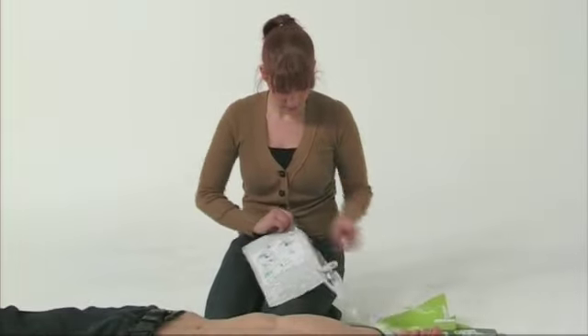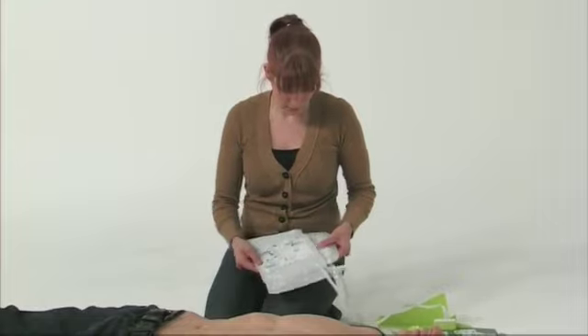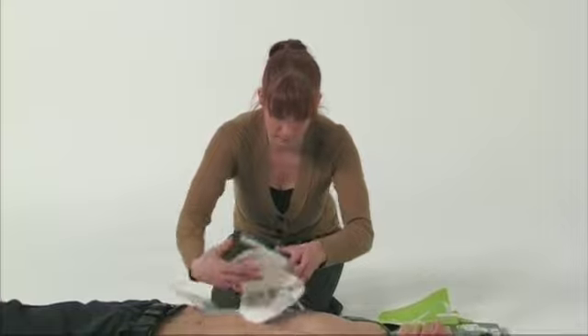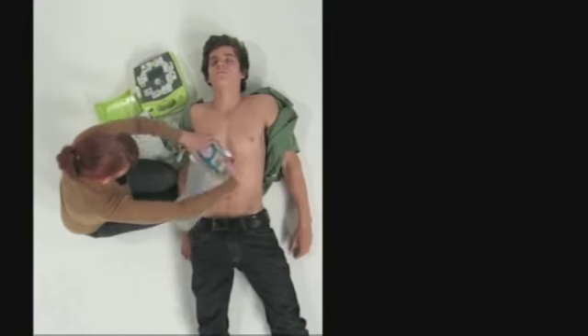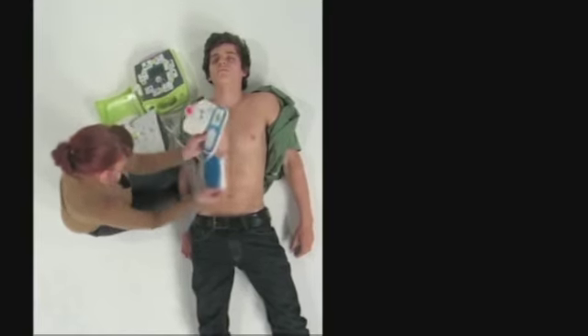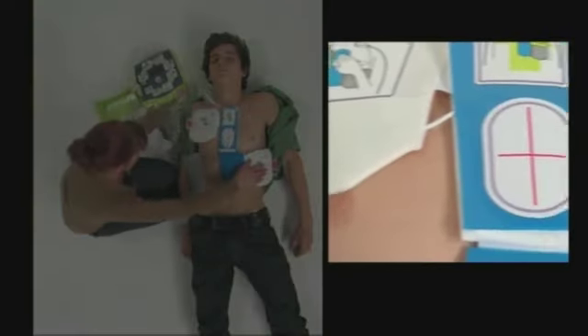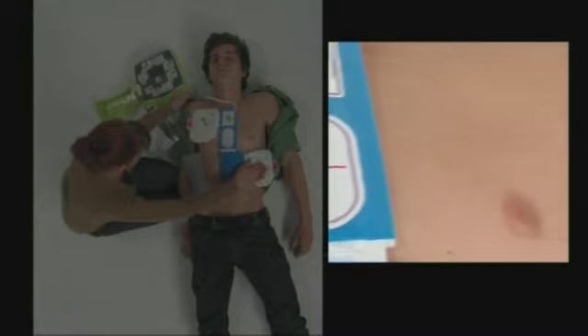Tear open the electrode pack and unfold the electrode pads. The CPR-D pads are a one-piece pad designed to be easy to place. Using the sensor's crosshairs to guide you, align the CPR landmark between the patient's nipples and the middle of their breast bone.